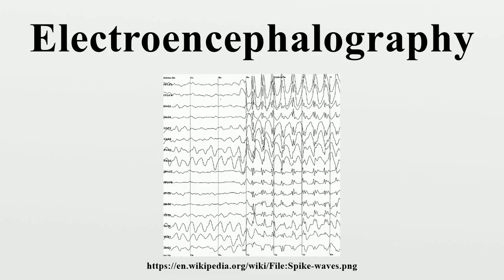The recording of these signals is referred to as electrocorticography, subdural EEG or intracranial EEG, all terms for the same thing. The signal recorded from ECoG is on a different scale of activity than the brain activity recorded from scalp EEG. Low voltage, high frequency components that cannot be seen easily in scalp EEG can be seen clearly in ECoG. Further, smaller electrodes allow even lower voltage, faster components of brain activity to be seen. Some clinical sites record from penetrating microelectrodes.